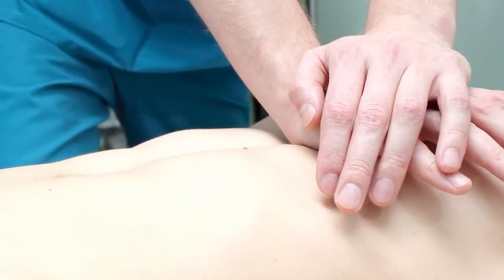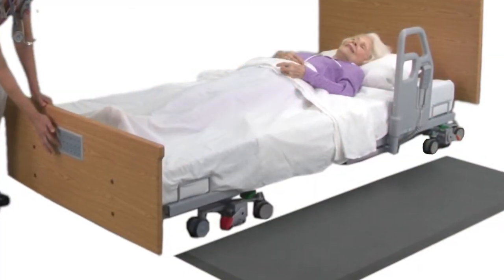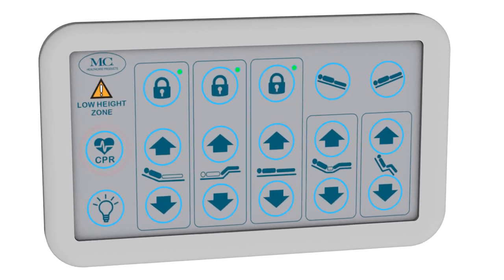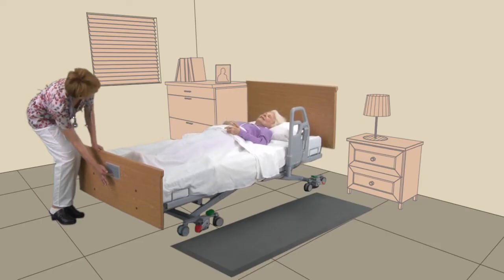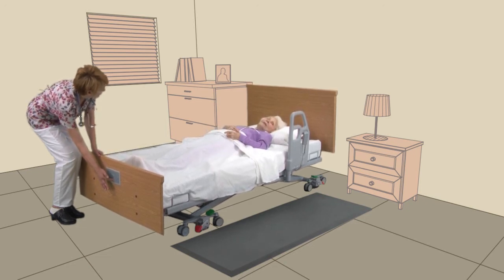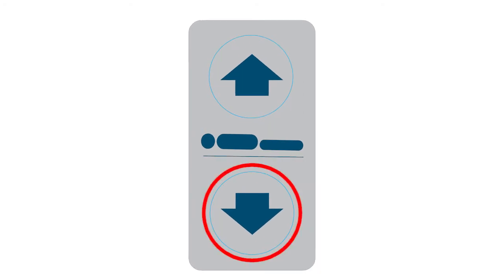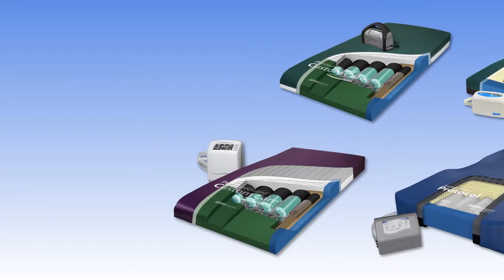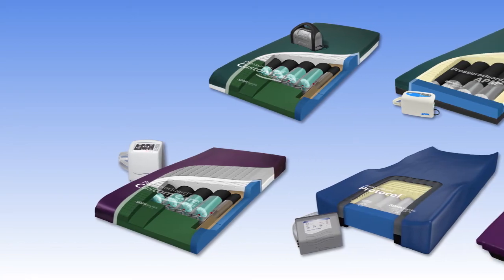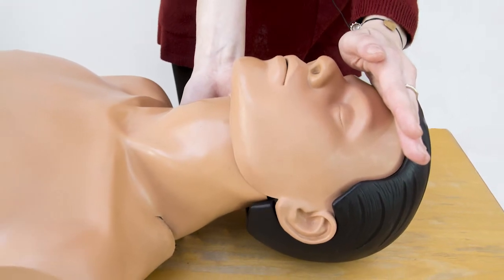For emergency care and cardiopulmonary resuscitation, CPR, the bed frame should be placed in the flat position. Most beds will have an electric or hydraulic mechanism to facilitate a quick drop of the head of bed into a flat position for emergency treatment. If a dedicated button does not exist, use the staff or patient control button for head of bed articulation and hold it until the correct position is achieved. The type of mattress the patient or resident is on will determine if it needs to be deflated or a backboard used to perform CPR.